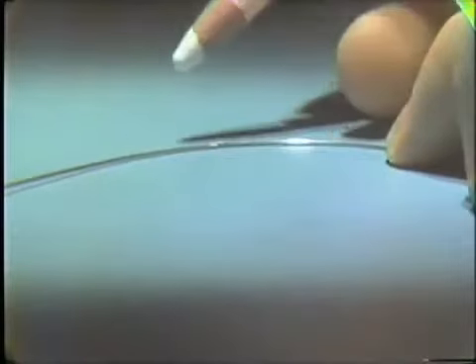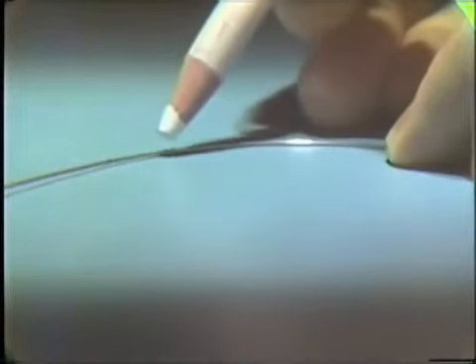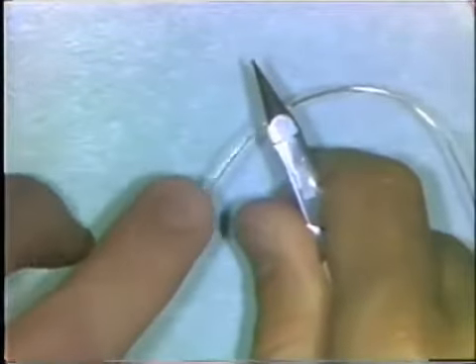You try the wire back on the table surface again and check the flatness. Now what has happened is that adjustment has moved the spot where it leaves the table down a bit. You mark the wire again and again place the wire in the beaks of the plier and make a small downward bend to adapt the wire to the table top surface. You continue making these adjustments until the curvature is completely flat, completely adapts to the formica surface or the glass slab.